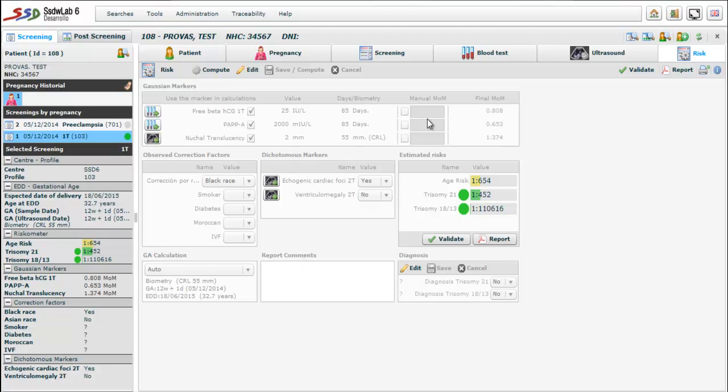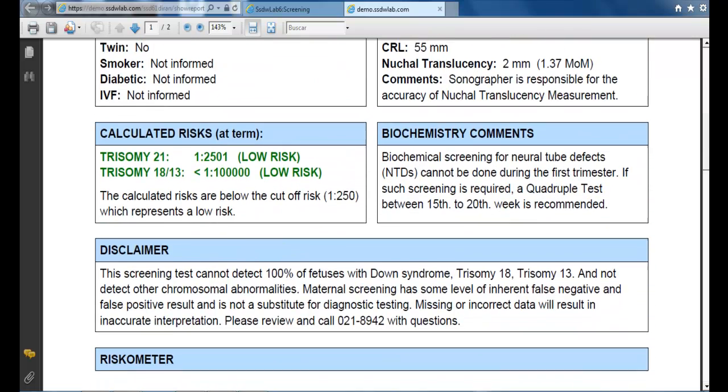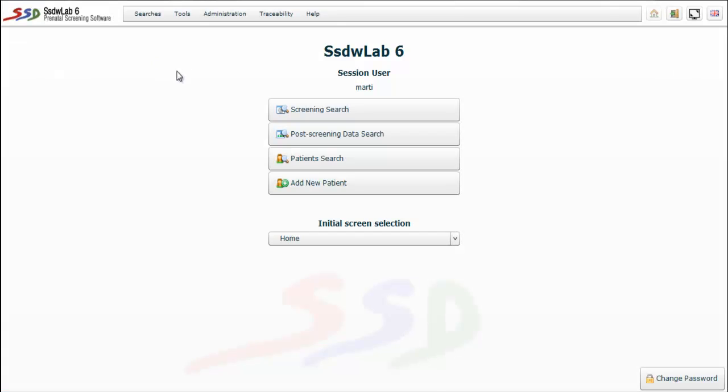The web program has a complete system of written reports generated in each screening. We can choose between several languages, for the printed report as for the resolution of the screen. It is a highly configurable program that works based on menus, which in turn have different submenus. We can observe at the top of the screen a menu bar.